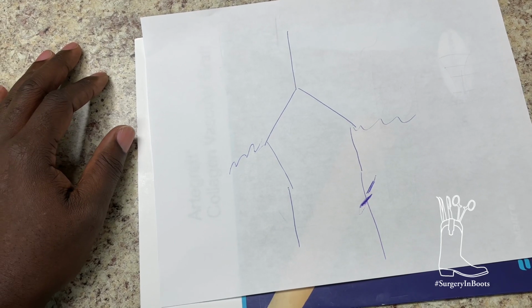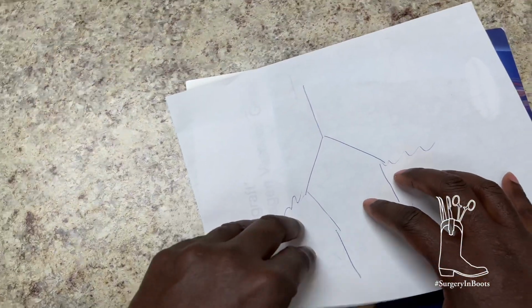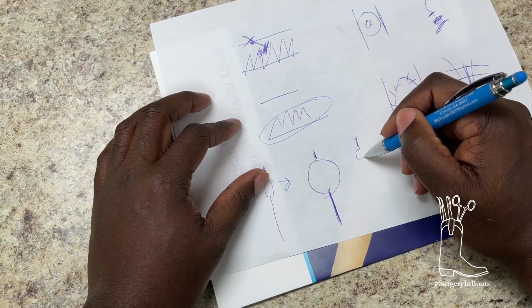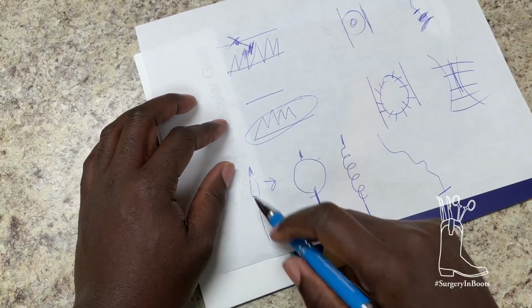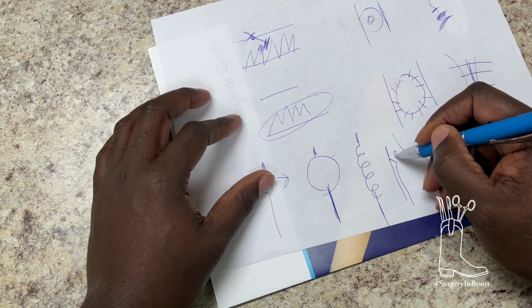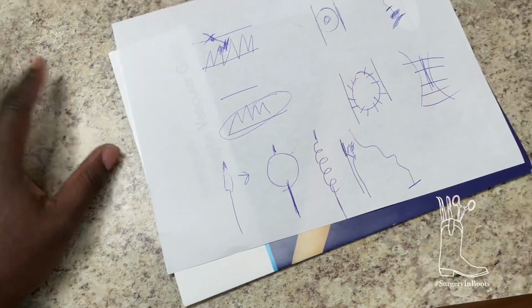And even the embolectomy, is that how they do embolectomy in other places in the body too? Yeah, same thing. Anytime you remove a clot. Now there are some fancy ones. They don't always use balloons. Sometimes they have one with a corkscrew in it, and you twist through, pull it out, and then you go back this way. They even have some with a little suction port on the side that sucks the clot out. But you have to go above through with that. Dang, that's super cool.